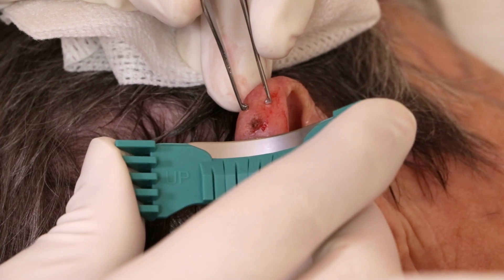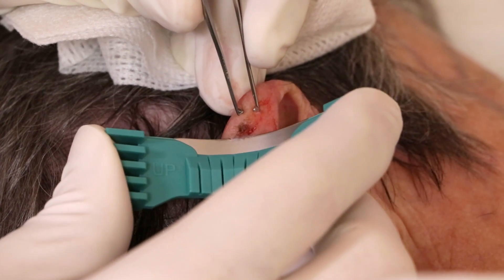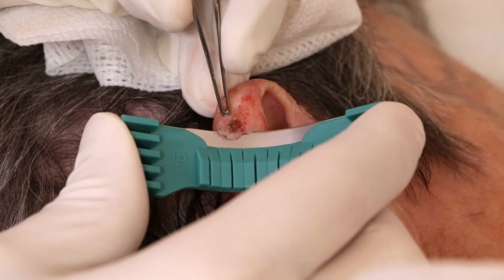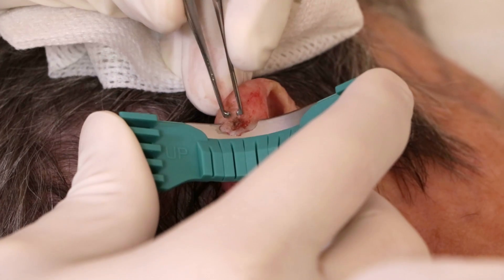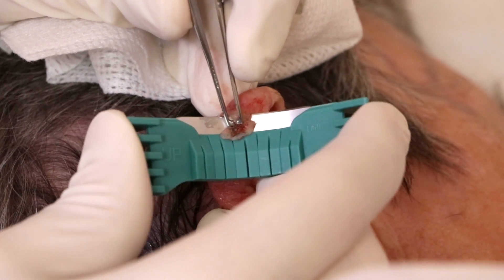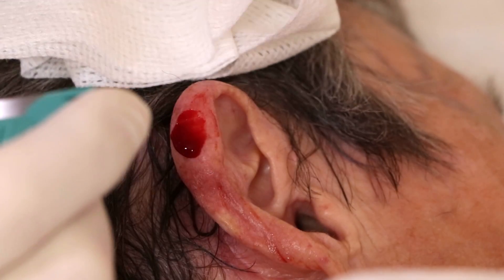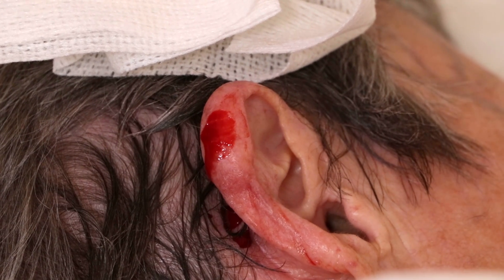And we shave. Let me get some clean gauze for that.